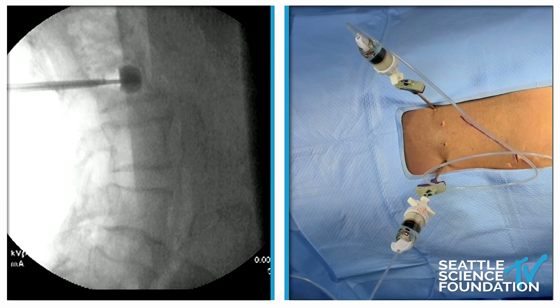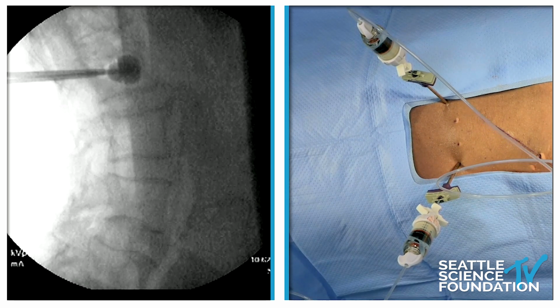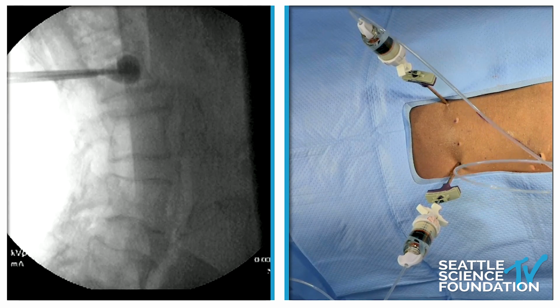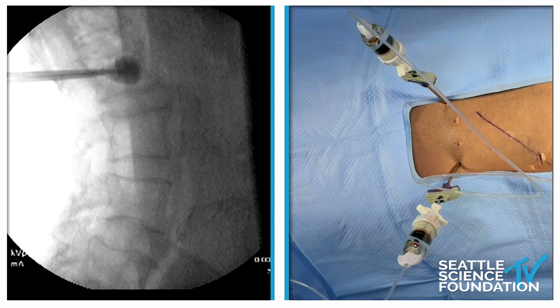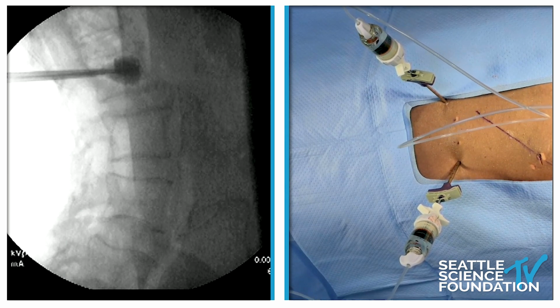And if a leak occurs anteriorly, laterally, left or right, it doesn't make any difference. If the leak goes posteriorly, that's where the neural structures live, and that's a very big and important problem. So when you see cement going into the posterior third of the vertebral body, as Doug is loading it from front to back, be ready to put the brakes on, because that's danger zone.